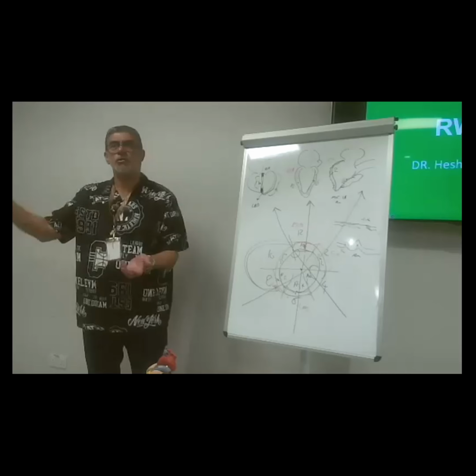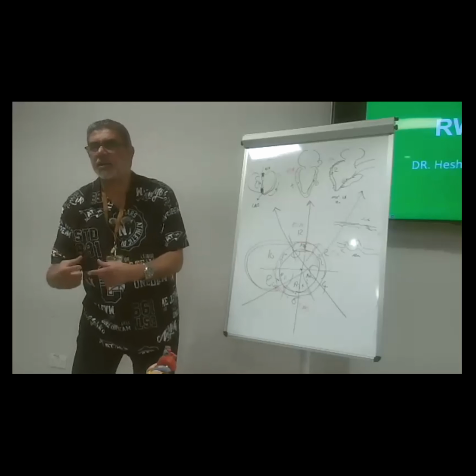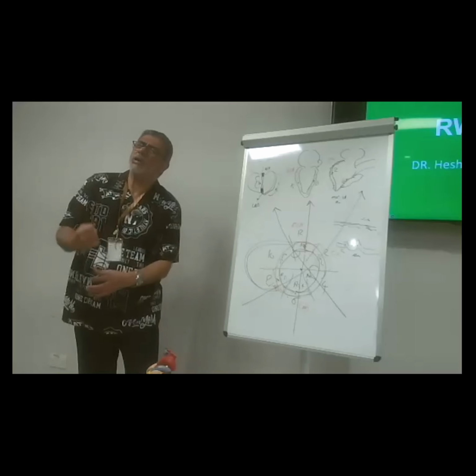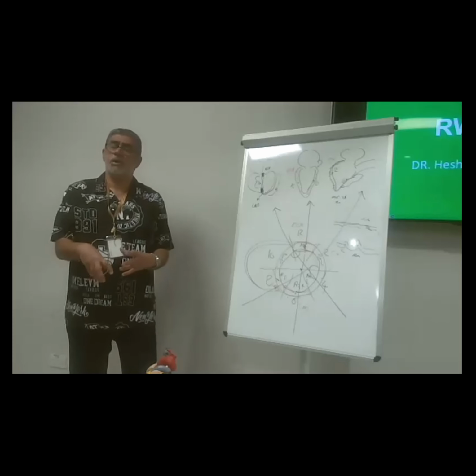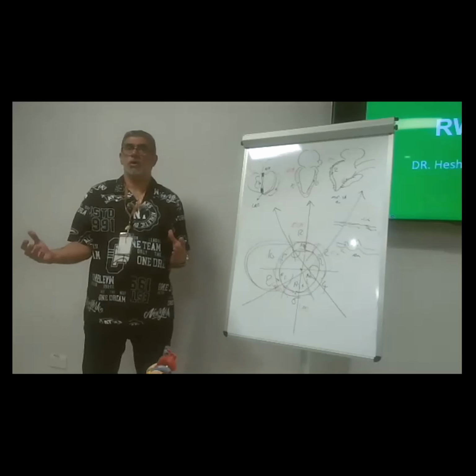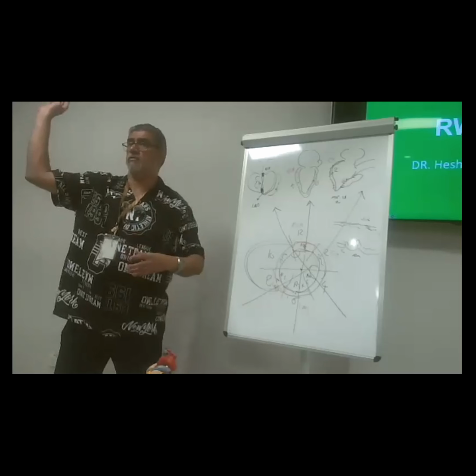It's the same when you tell the surgeon we have a problem in the inferior area. For example, severe aortic stenosis, the aortic annulus was tight. What to do? To make an aortic root dilatation, or say this size will be enough. So he inserted an oversized valve, thinking it may be okay, it may match. It was not. It was stretching this area, the RCA, which affected here. The only solution is to remove the valve.